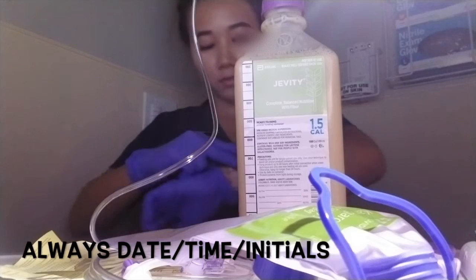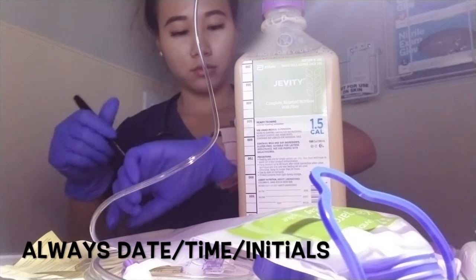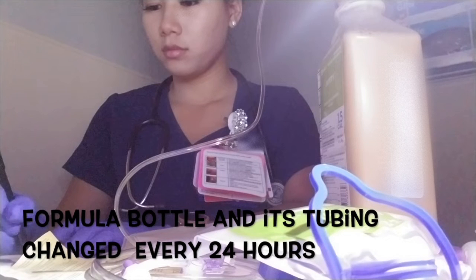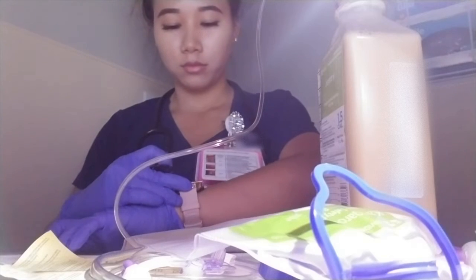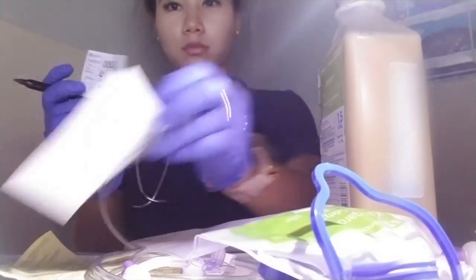A labeling sticker will be provided in with the kit to write down the date and time of when the formula bottle was spiked open. Depending on facility's protocol, but usually a formula bottle and its tubing is changed every 24 hours. After 24 hours, the formula is expired and can crystallize in the bottle or in the tubing, which is not good for your patients. Don't forget to include your initials as well.